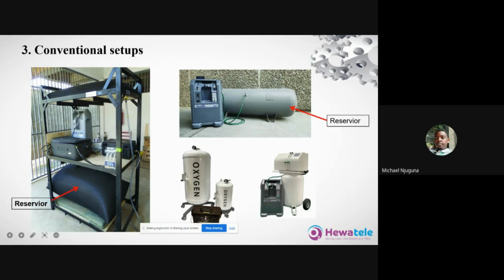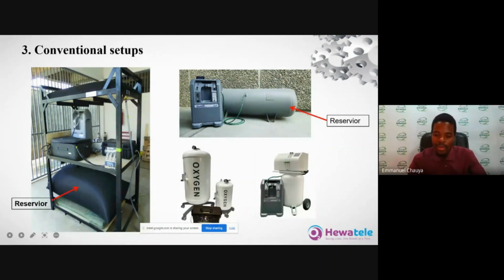And it is in those events that users have really appreciated the system, because when there is no power, the concentrators can't be used, but the facilities that have low pressure reservoirs have oxygen in between those power events. And they really liked the device. There was another brand that we tried to bring in here in Kenya, but it didn't work because it wasn't robust. But for the Biomedical one, there is a positive vibe as far as the system is concerned.